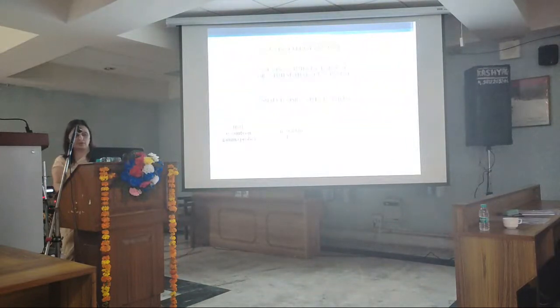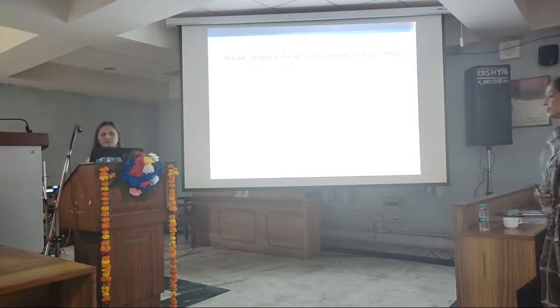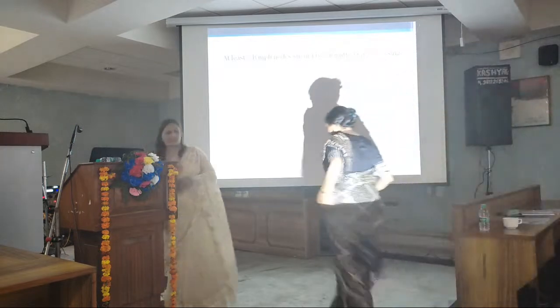Either it can be hot on the gamma probe, it can be blue, or it can be both hot and blue, or it can be neither of these but just palpable lymph nodes. All these 4 situations are counted as sentinel lymph node. Basically, we define the sentinel lymph node as hot, blue, and palpable lymph node. Then, after harvesting the lymph node, we give the specimen to the pathologist, and Dr. Vana will tell about the lymph nodes, how they do the procedure with that.